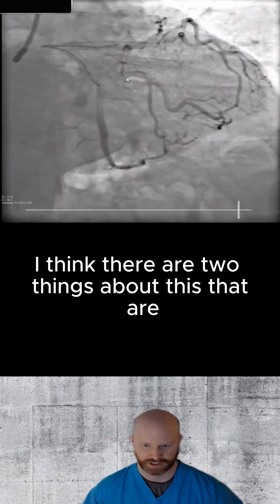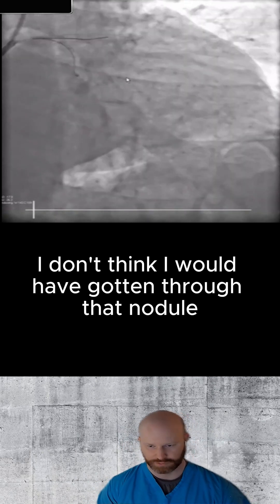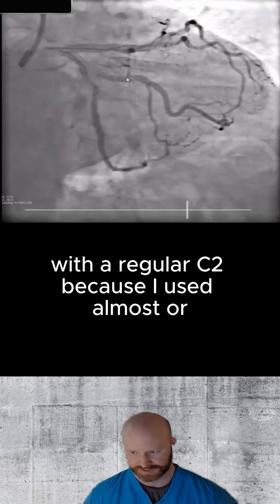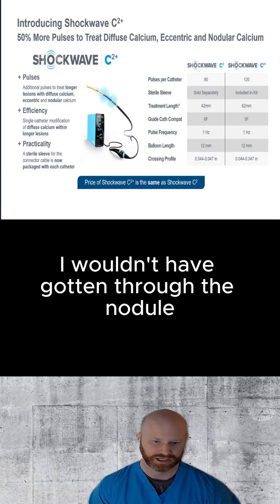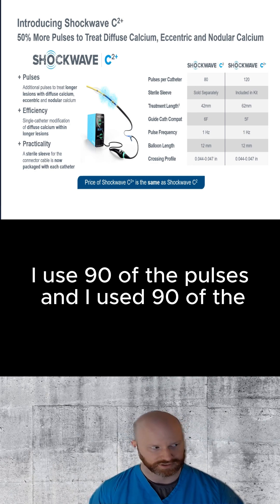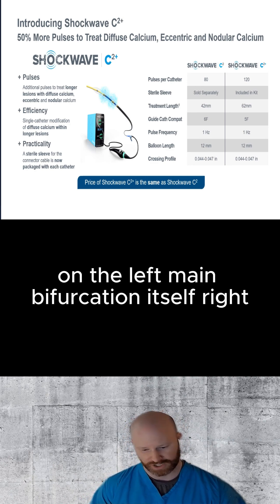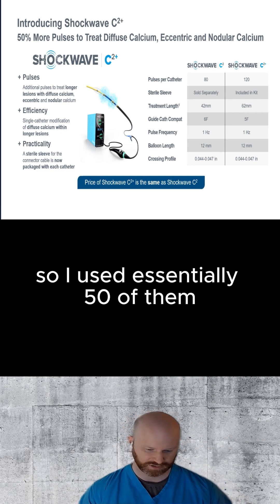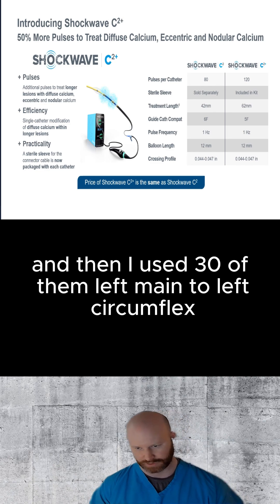I think there are two things about this that are kind of unique. The first is I don't think I would have gotten through that nodule with a regular C2, because I used 80 of the pulses on the left main bifurcation itself. I used essentially 50 of them left main to LAD and then I used 30 of them left main to left circumflex.